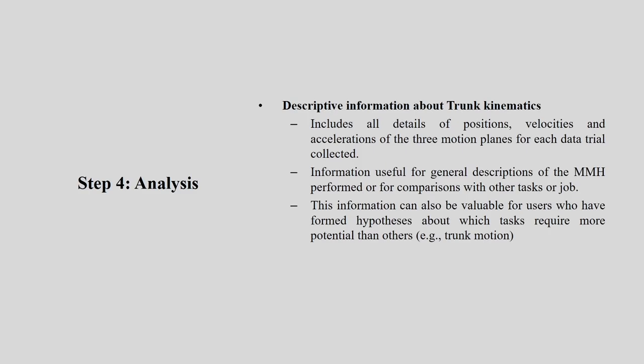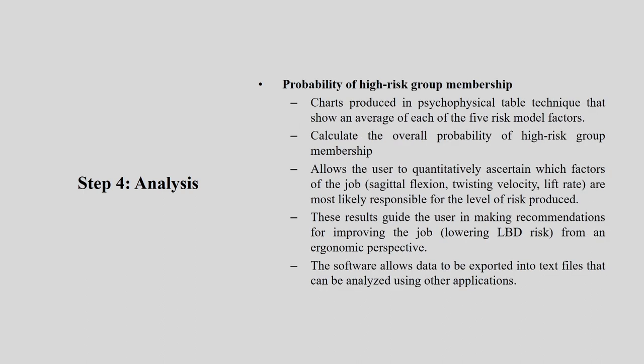This information is useful for a general description of the MMH performed, or for comparison with other tasks or jobs. It can also be valuable for users who have formed a hypothesis about which task requires more potential than any others. That is for the descriptive information about the trunk kinematics. And for probability of high risk group membership, these are the points you are going to get.